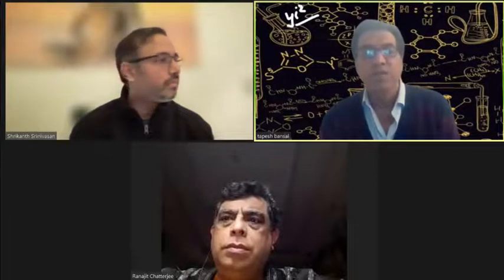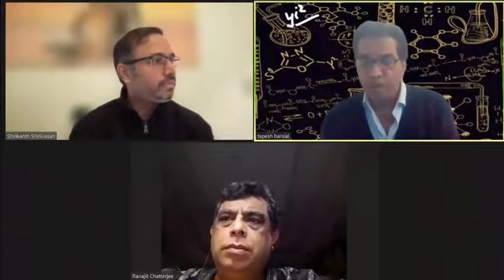So it's in two parts. The main focus is on asynchrony to be delivered by Dr. Srikanth Srinivasan sir. All of you are aware of him. He is head of critical care department at Manipal Hospitals, Delhi, and also co-authored a book on ultrasonography in the ICU. The second part, which is much shorter, just runs through some abnormal waveforms for you. They are not classically called asynchrony, but they are abnormal waveforms and can be taken up with asynchrony in a loose sort of way.